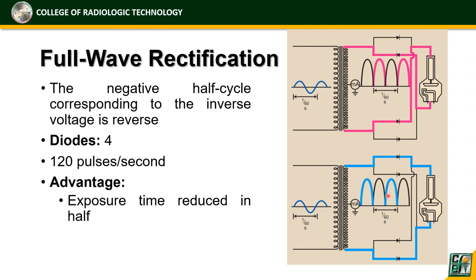Tingnan niyo yung pathway, isang way lang ang pinanggagalingan or ang dinadaanan. These are the diodes.